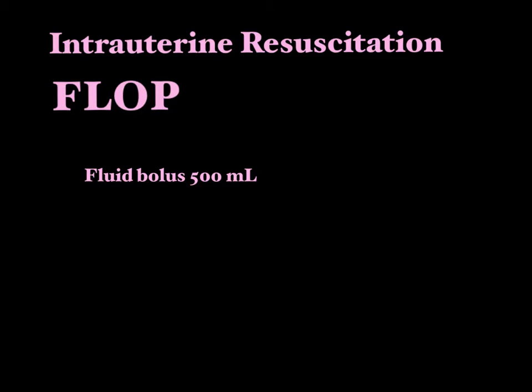Okay, so I'm going to give you another mnemonic, and this time it's called FLOP. So we have VEAL CHOP, now we have FLOP. And what it stands for is fluid bolus. Mom has extra circulating volume. What's the purpose of that? Well, the more volume there is, the more it's getting to the baby.